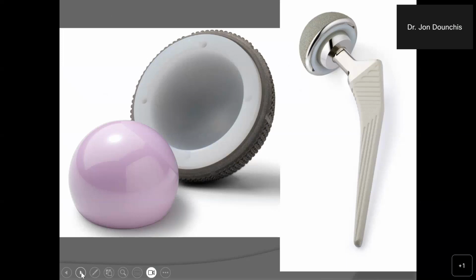And this is just kind of an overview of hip arthroplasty. So modern hip design, the femoral head is a ceramic material. The titanium shell there is lined with a very special cross-linked polyethylene liner. So the polyethylene, compared to prior generations of polyethylene, has been cross-linked to provide further durability of the material. And this has been a substantial improvement for our patients in both knee and hip arthroplasty, with this polymer being extraordinarily durable compared to prior generations of polyethylene. Next slide.